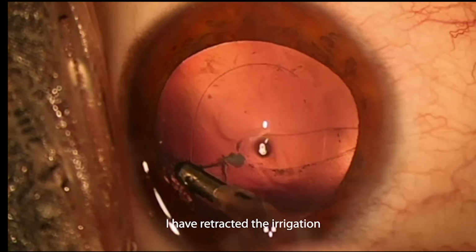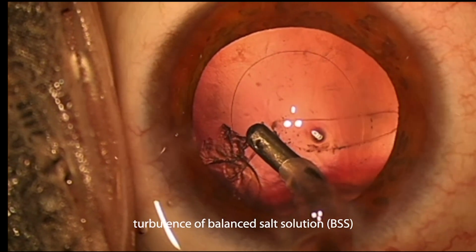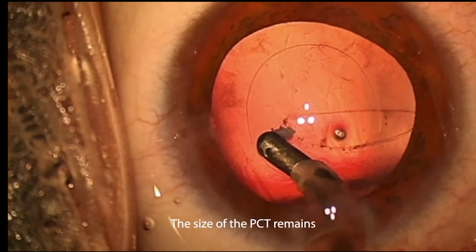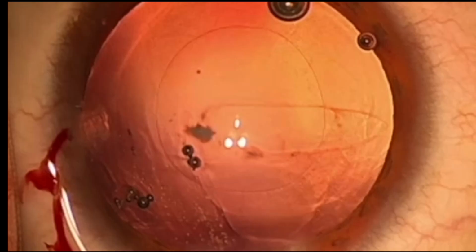I have retracted the irrigation aspiration sleeve to minimize the turbulence of balanced salt solution against the anterior hyaloid face. The size of the PCT remains unchanged from the beginning of the surgery.